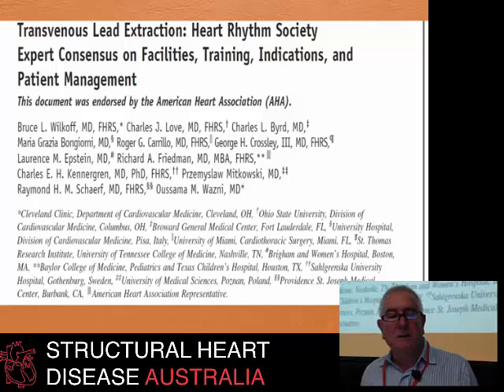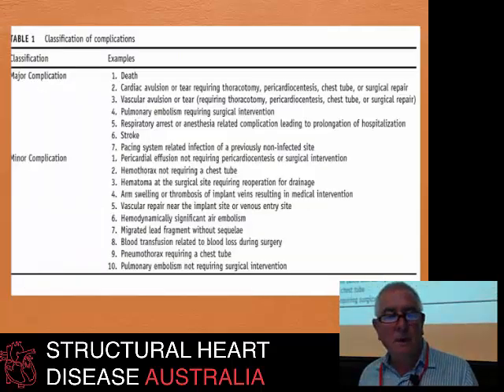Like many things these days, we have expert committees, and these gentlemen here, most of whom I know, are real experts. They've done a lot of lead extraction, and they've come up with a consensus for indications for lead extraction, which I think are quite reasonable, but we're not going to go through them tonight.